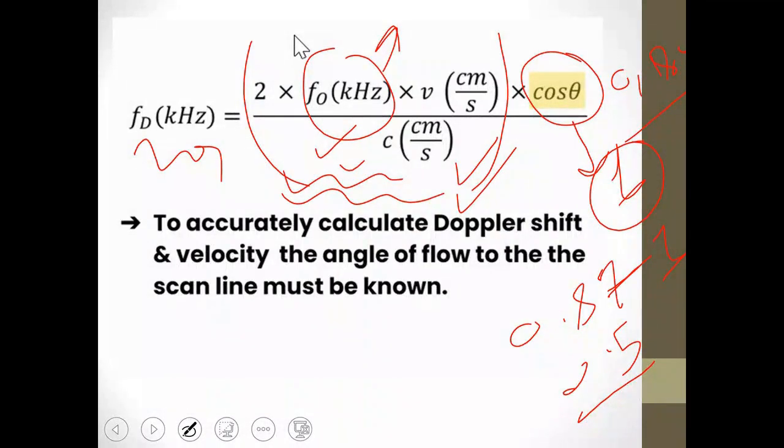So in this case, the original value of the Doppler shift will not decrease at all if you choose a parallel angle, or your maximum threshold is 60 degrees. This 60 degrees is considered the threshold for the angle of your transducer on the blood flow of your vessels. All right. Now let's go back to the topic of speed.